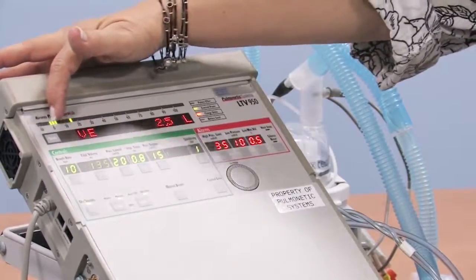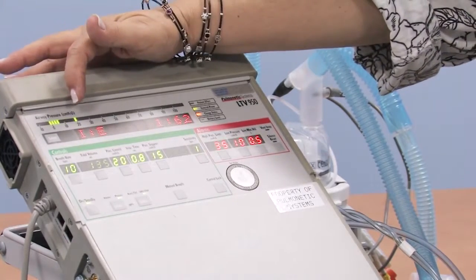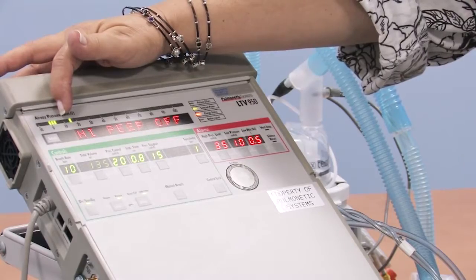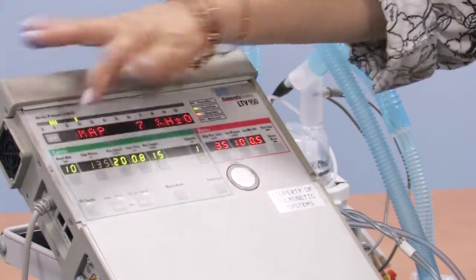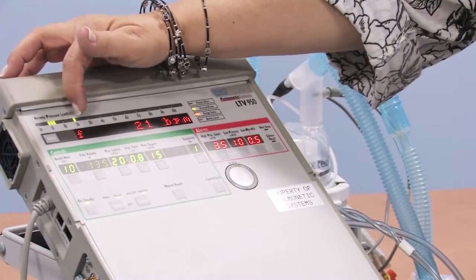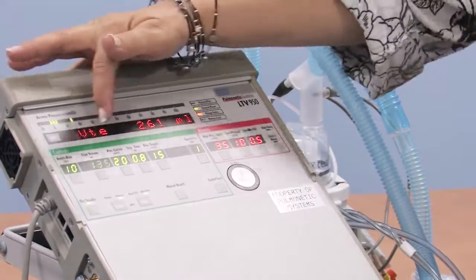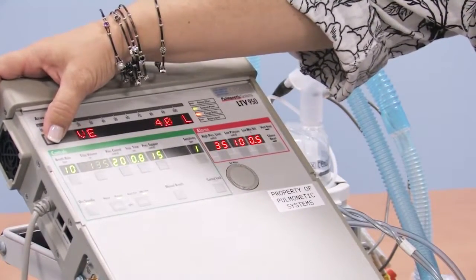We can see the settings up here under the airway pressure window. So whenever the machine goes up and down, you can see it goes up to 20 and down to what looks like 5, between 10 and 0. So there, I can look and tell you, I don't have to look at the valve. I know that we've set the 5 of PEEP here, because it's showing me up to 20 and down to about 5. In this window, I can also look at different values.